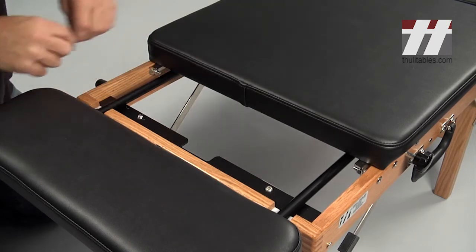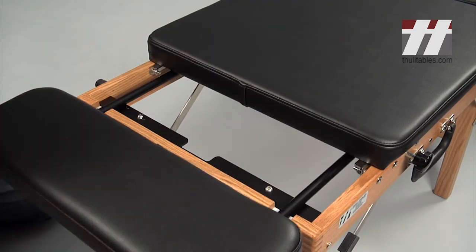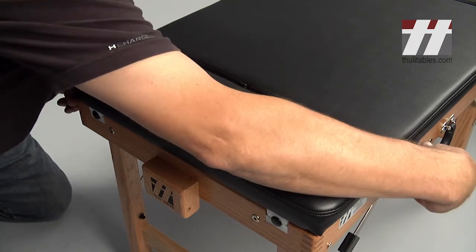Your Tour portable table is now retrofitted to be used with the Thuli Tables Flexion distraction device.